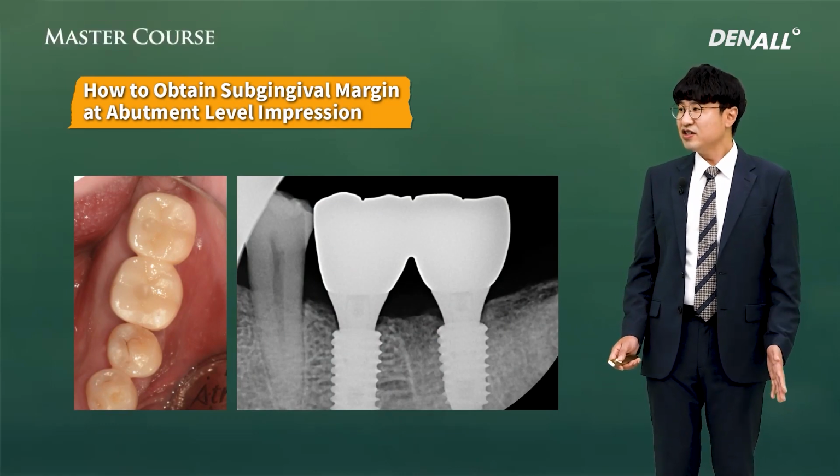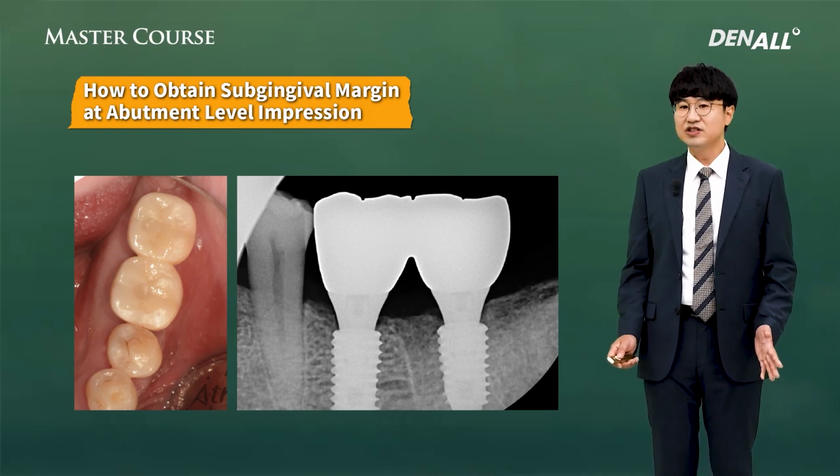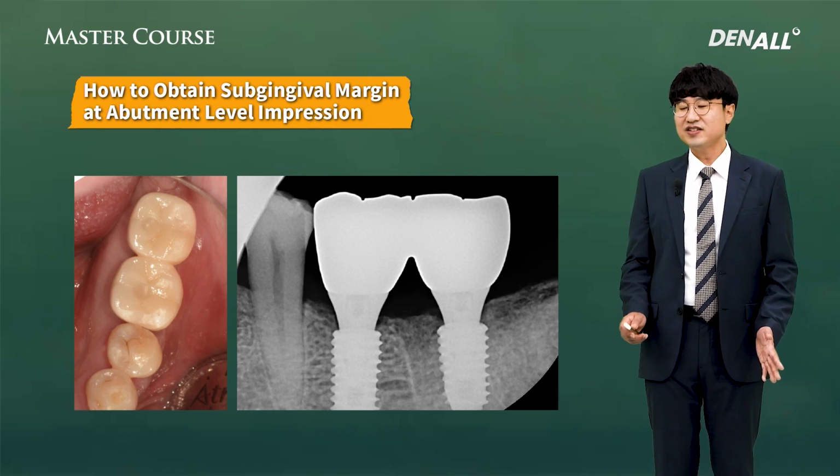So if you can use it without stock abutment modification, just take the impression up to the area you can see. And the next step is, by merging the stock abutment of the same size, you can get the image and make the final prosthesis.